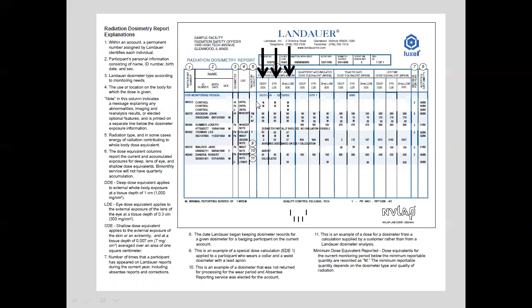But anyways, so on that, the types of doses that it's going to measure is your deep dose. This is the dose which is going to give you what is your chance of getting a cancer from your occupational exposure. And then they have eye dose. How much radiation are you getting to your head? Okay. And then the last one is shallow dose, which is your skin dose. I don't know if you've seen, some doctors wear a radiation ring, and this is just giving what's their exposure to their extremities. And I think Venkat at the VA is the only one.